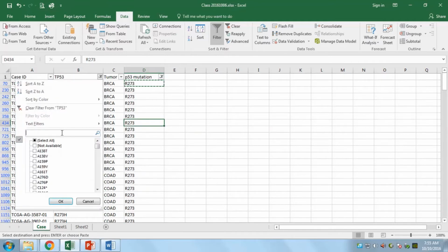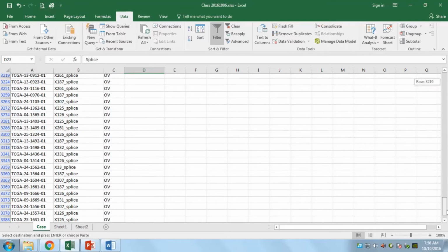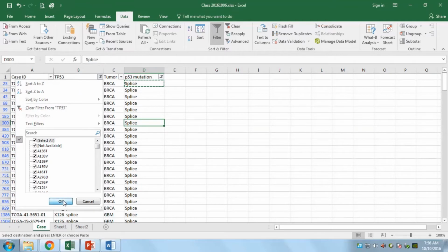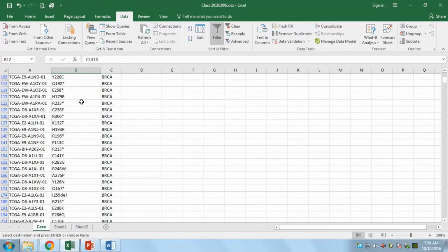Of course you also have some mutation which are splicing variant. So you see these are all the splicing mutation. I will just designate them as splice. And what type of mutation haven't we covered, let's look at that. At this point you will see that mostly the missense mutation and the truncated mutation are not being identified yet, so we will come to that later on.